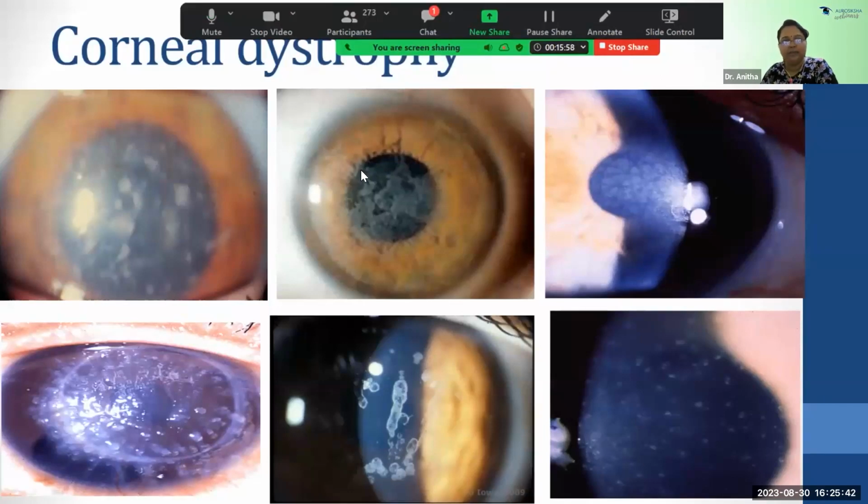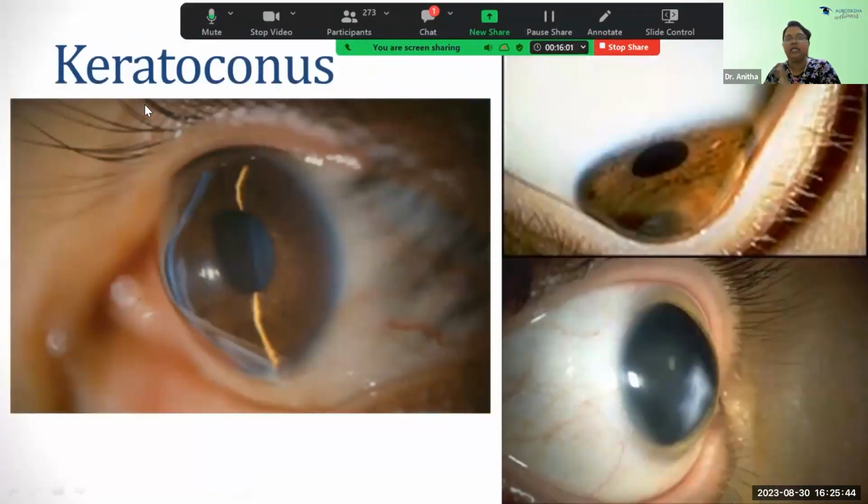Corneal dystrophies, you are familiar with all the conditions. Keratoconus, I just wanted to tell you one point in this. Here, if you pick up scissor reflex at the earliest in the vision center, that is a success of every vision center, I will say. Because this condition can be treated if identified at an early stage. If a patient has a minimal cylinder or minimal myopic astigmatism, presents to us and we do a C3R in them, it definitely stops the progression and they get better visual acuity.